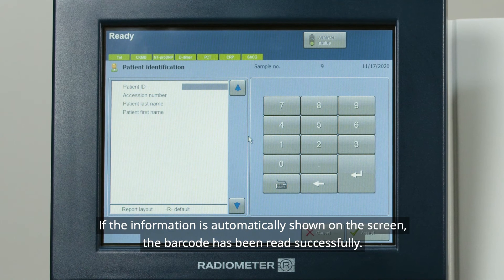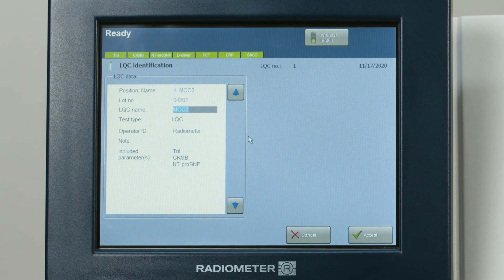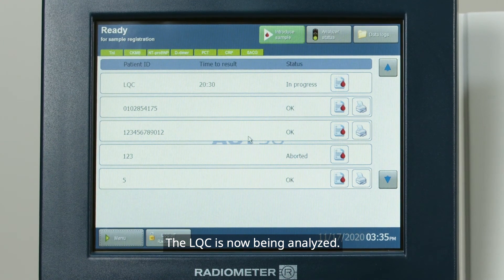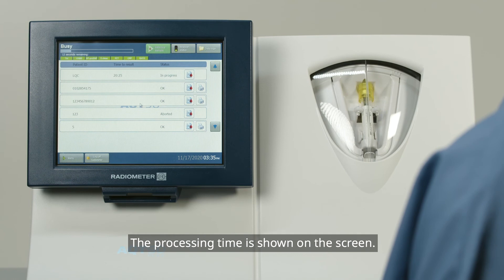If the information is automatically shown on the screen, the barcode has been read successfully. Now press Accept and Start. The LQC is now being analyzed. The processing time is shown on the screen.